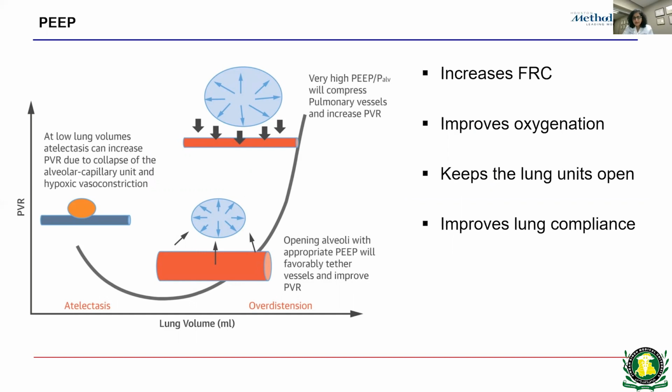A moderate level of PEEP, 3 to 5 centimeters of water, is generally recommended and may be beneficial for all intubated and ventilated patients. A high PEEP may be clinically necessary for patients with restrictive lung diseases, such as ARDS. Avoid the use of zero PEEP, although it is possible. PEEP is usually constant in all ventilation modes. An exception is when you use biphasic modes, where PEEP can alternate automatically between 2 set levels.